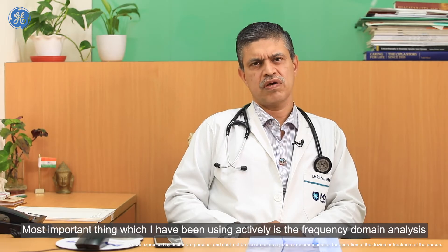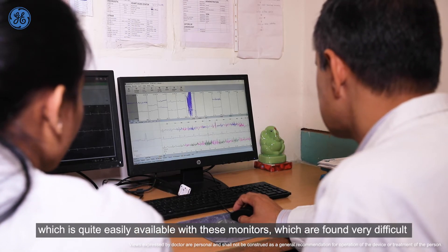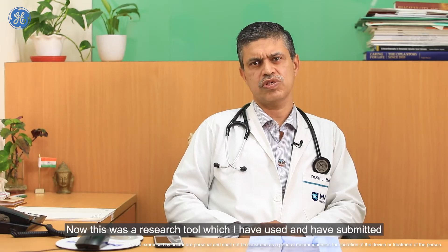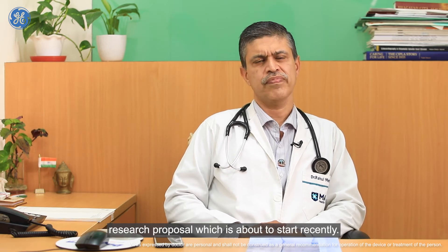A more important feature I've been actively using is the frequency domain analysis, which is quite easily available with these monitors. I found it very difficult to find with other monitors early on. This was a research tool which I have used, and we have submitted a research proposal which is about to start.